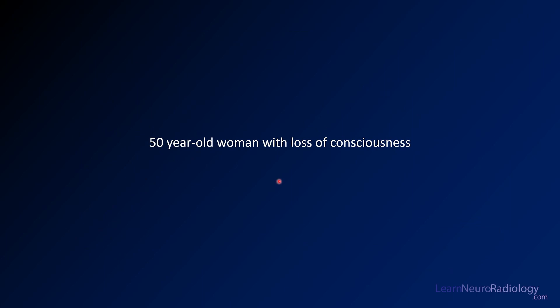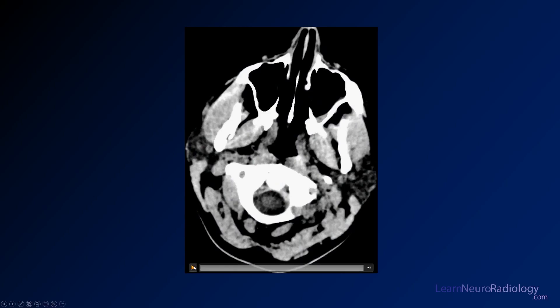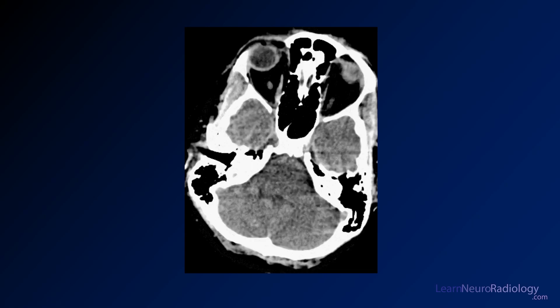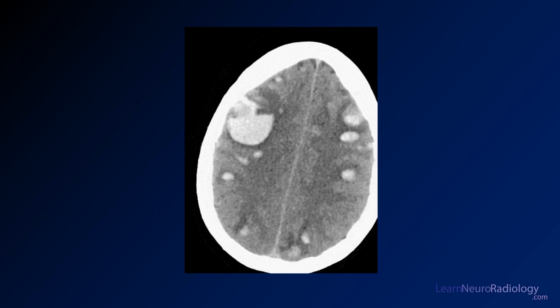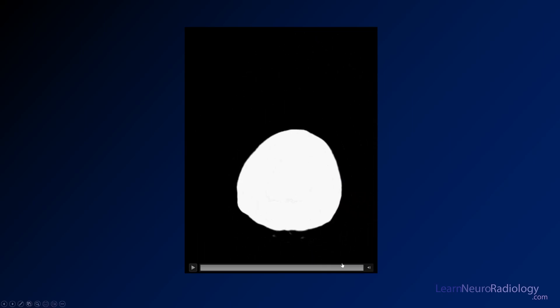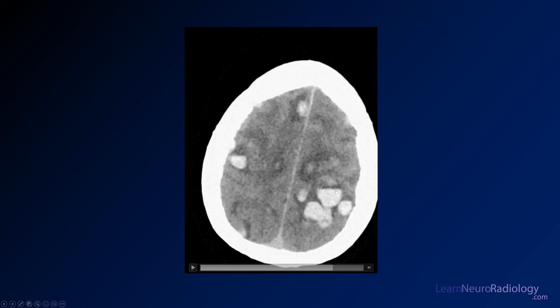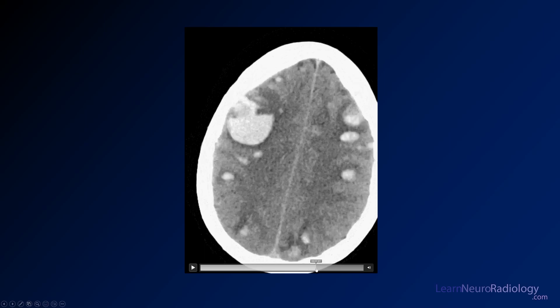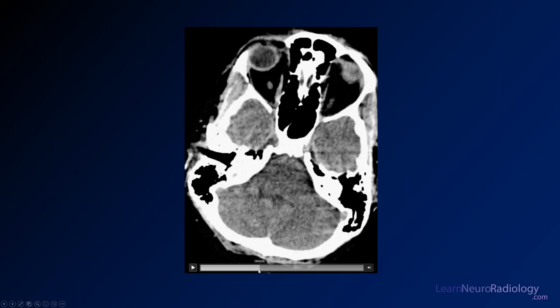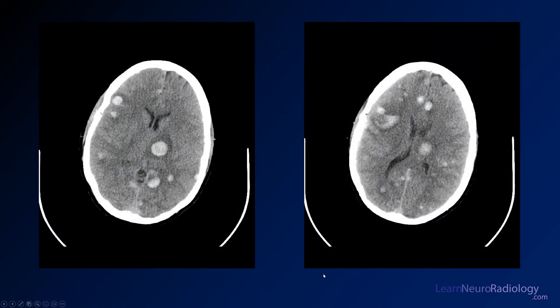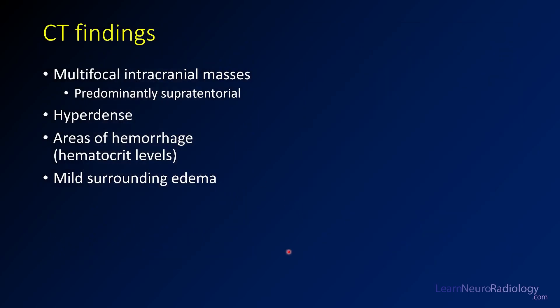Our second case is a 50-year-old woman with loss of consciousness. Looking at the CT, it doesn't take long to figure out there are a lot of problems. You can see there are many masses — many of them are hyperdense, and there appear to be fluid levels as dense as hemorrhage. So you've got a number of hemorrhagic lesions: masses that have some hemorrhage. Describing representative slices: hyperdense masses, edema around them, multiple lesions — predominantly supratentorial, hyperdense with areas of hemorrhage, and hematocrit levels that really tell you there's hemorrhage there. There is surrounding edema, but not a lot of midline shift or downward herniation.